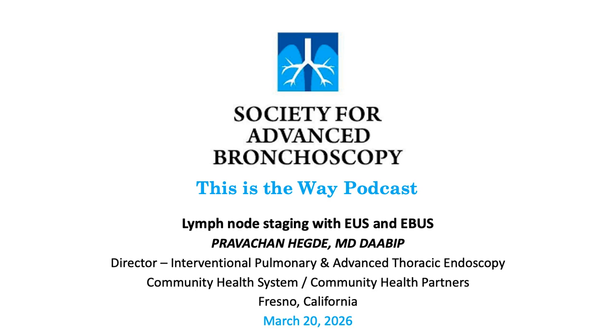The only difference I see is in difficult locations, particularly para-aortic station 6 or station 5, where you may encounter difficulty accessing those stations.